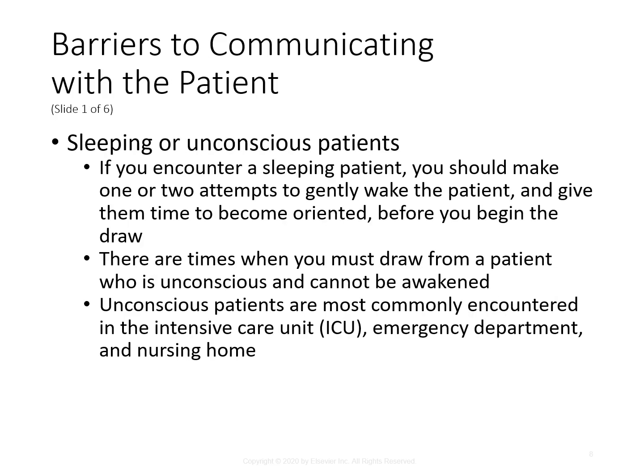Sometimes there are barriers with the patient communicating. Especially in an inpatient situation, they could be sleeping or unconscious. If you encounter a sleeping patient, you need to make sure that you try to wake the patient up and give them time to become oriented before you do the draw. Sleeping patients cannot give informed consent or confirm their identity, and obviously you don't want to be woken up from a needle either. So make sure you are trying to do that.